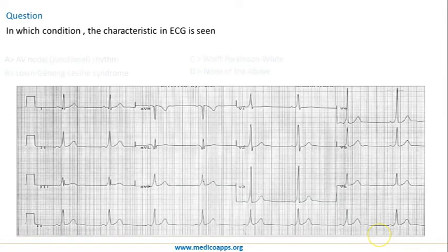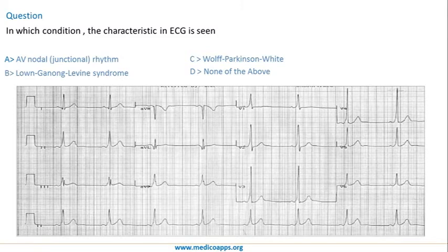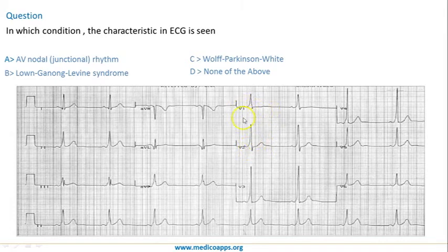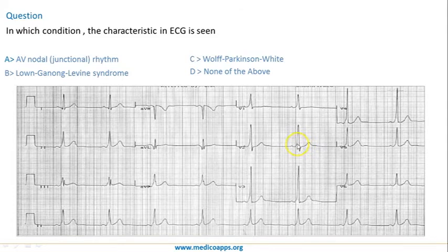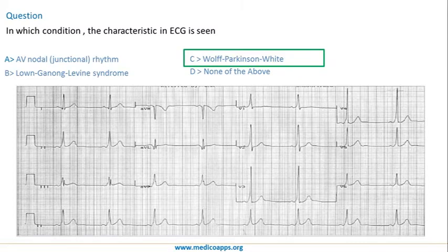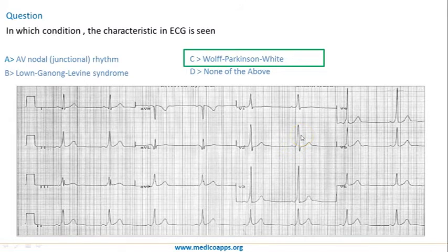Let's look at another question: in which condition is this characteristic ECG seen? Again, the PR interval is reduced and you can see the characteristic slurring. Students sometimes get confused between a wide QRS complex and this slurring. Remember, in WPW syndrome not only is the QRS complex wide, but the PR interval is also reduced. Both a reduced PR interval and slurring of the QRS complex point towards Wolf-Parkinson-White syndrome — you must look for both features, not just a wide QRS complex.